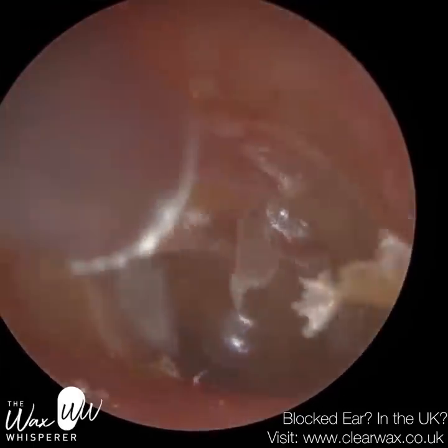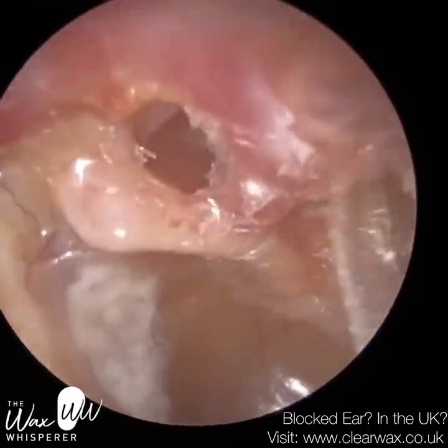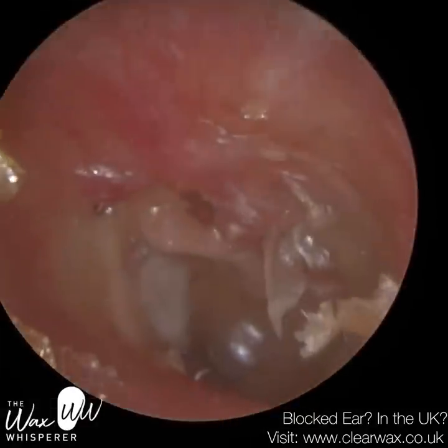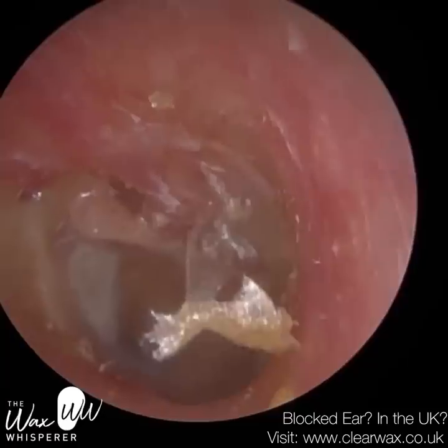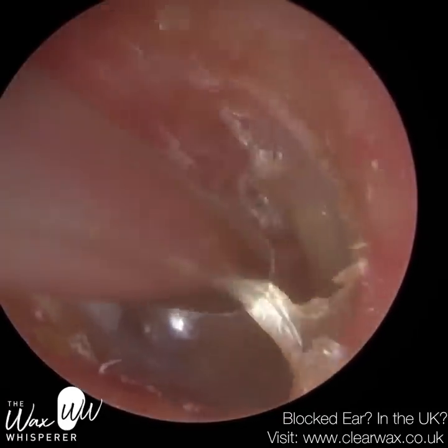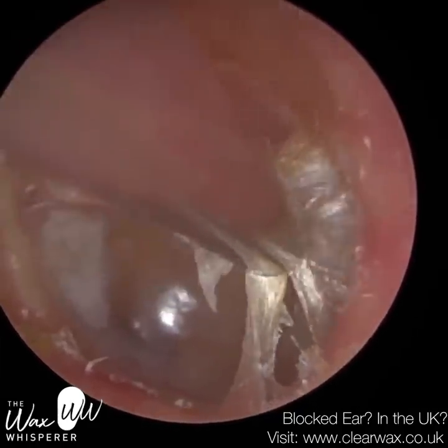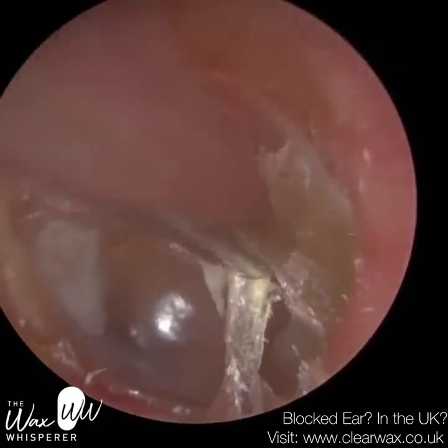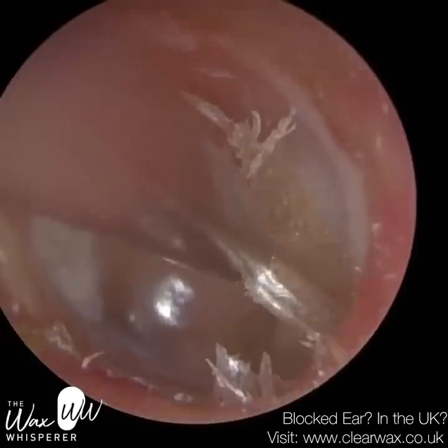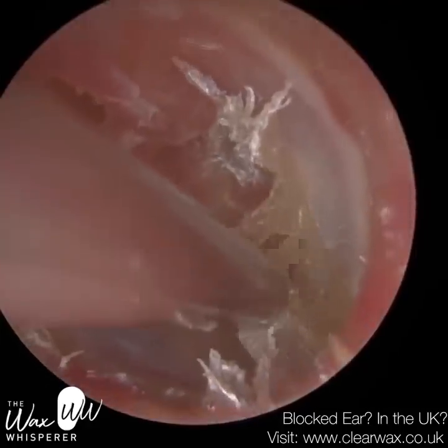This patient has also got a retraction here. It's almost like the long process of the incus is visible and protruding outwards more than the hammer bone — the malleus. We've got three bones in the middle ear: the hammer bone, which is attached to the eardrum; the stapes bone, also known as the stirrup, which is attached to the organ of hearing, the cochlea; and linking those two bones, you've got the anvil, also known as the incus — the middle bone. It's almost like the incus is more visible and protruding laterally towards the entrance of the ear than the hammer bone.